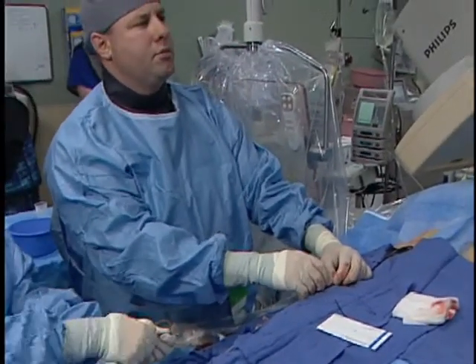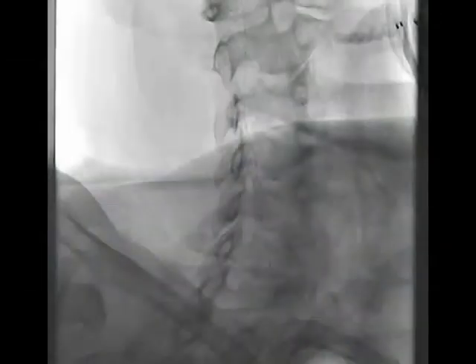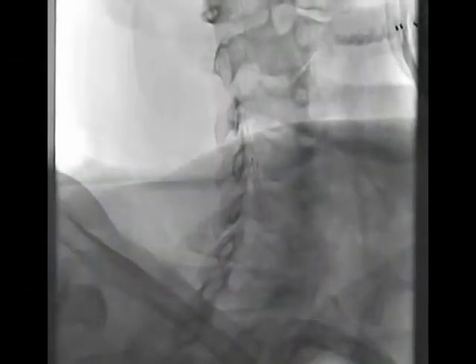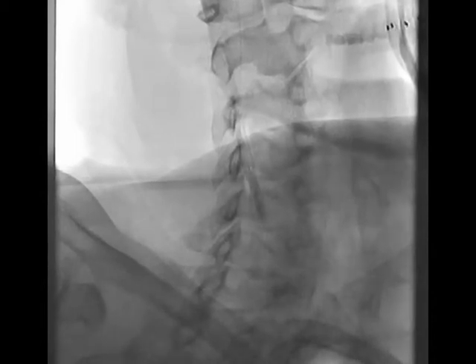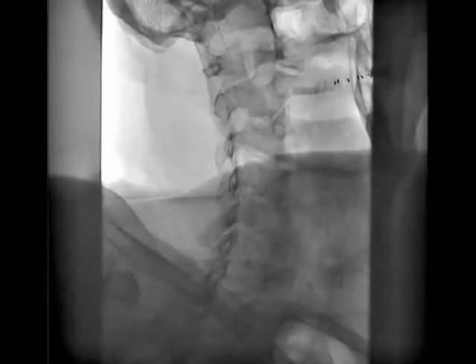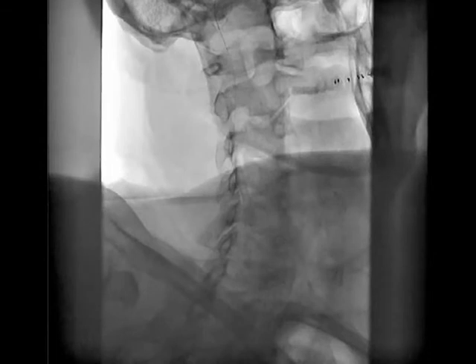I'll position the balloon up there and go up to eight atmospheres. You can see the hourglass shape on that stent is nearly completely resolved — I think that's fine. We'll go ahead and take this out. You can see that there's a little bit of an ulcer crater that's trapped behind that stent. Those will usually fill in over time. The stent looks very nicely expanded and I think it's in a good position.